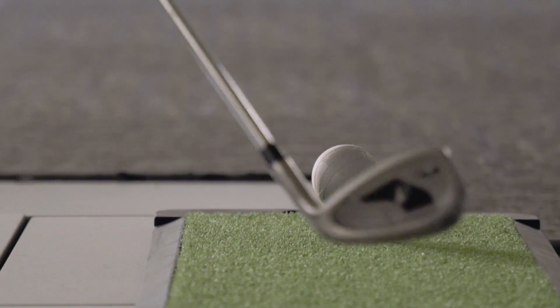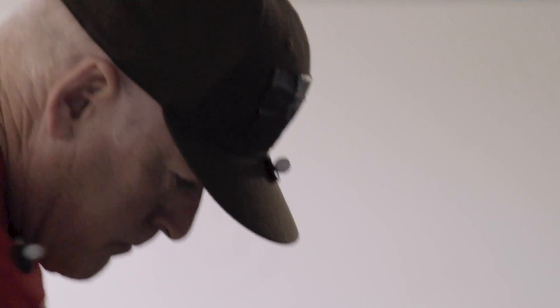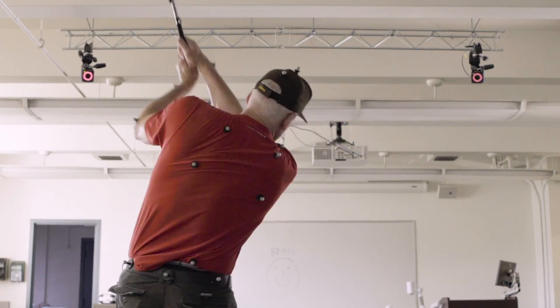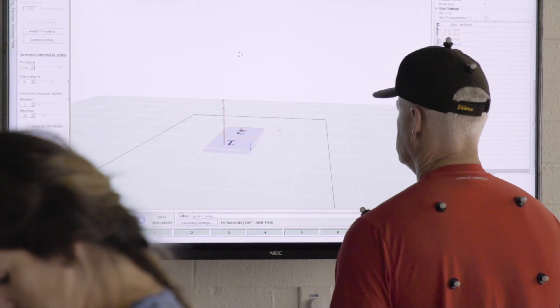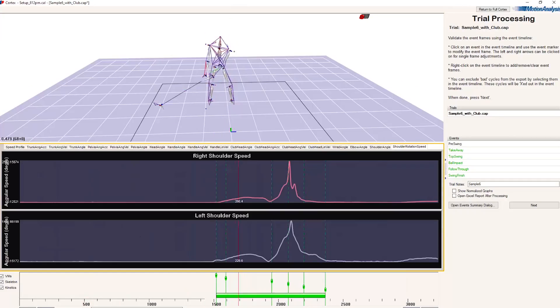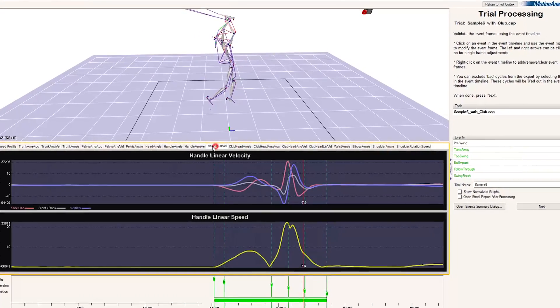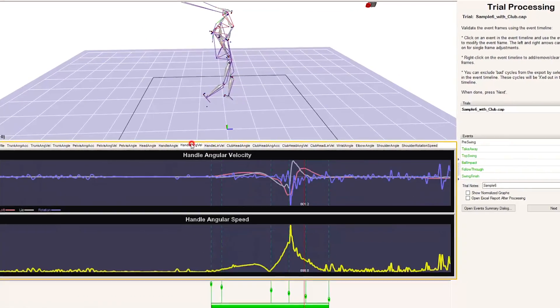Moving on to GolfTrack — same approach, using marker-based data to look at things like swing plane and the X-factor, which is the relationship between trunk rotation and what the pelvis is doing.